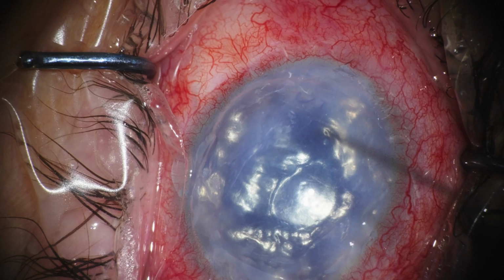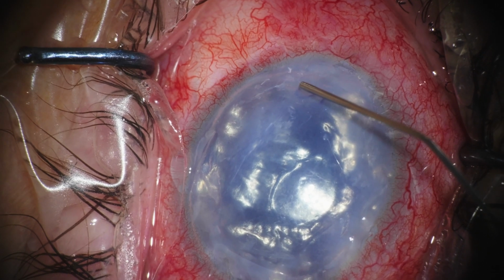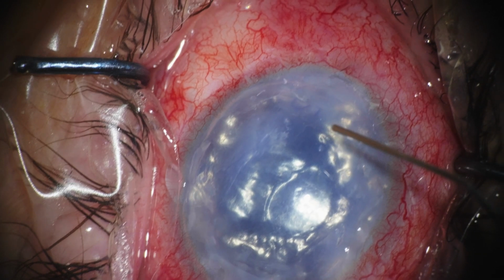So at this point in surgery, we see that there's an S mark that's properly positioned. We see no folds, so we take the win and we inject the final air fill. This patient was rebubbled the next day, and he's doing fine now at 3 weeks after the surgery.